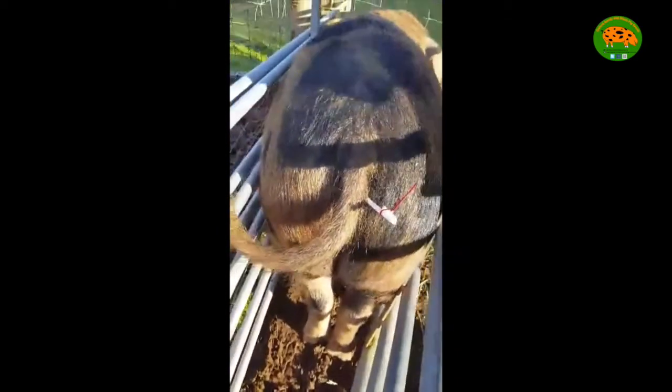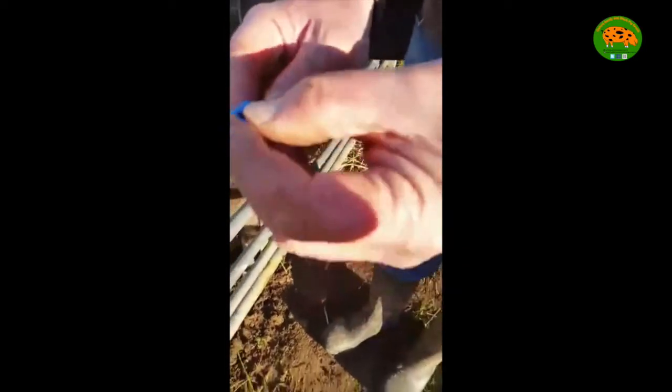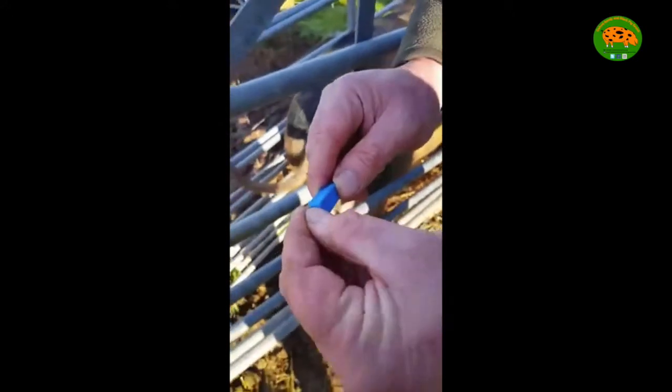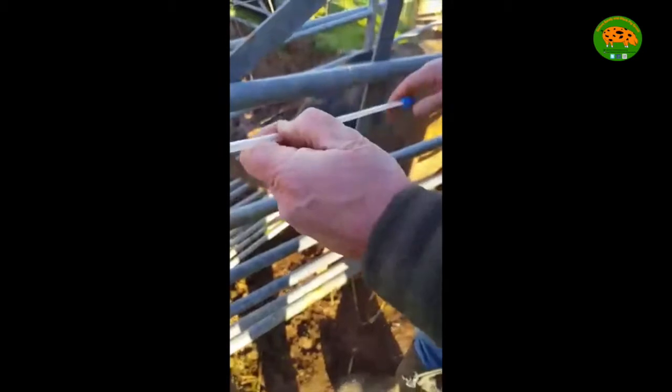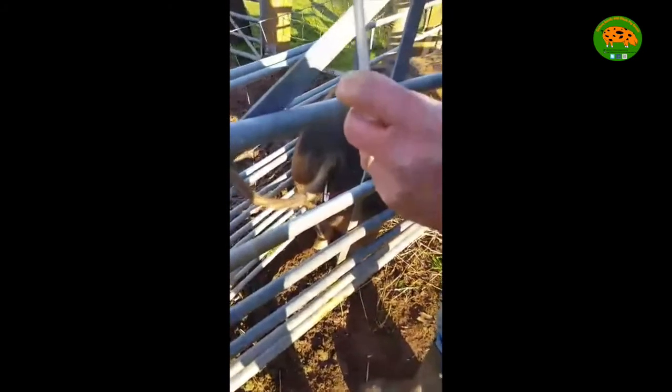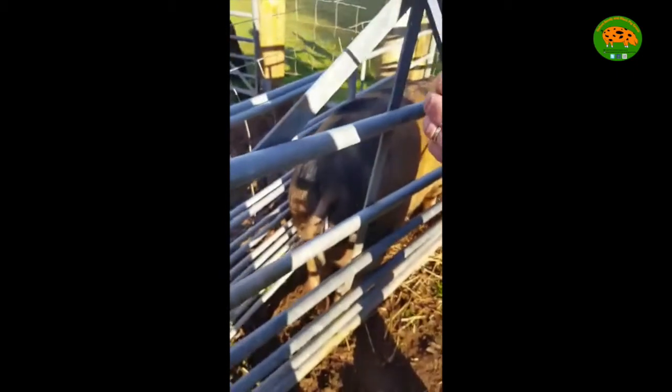With the Deer Park catheter, they have a cap on here at the end, so you wouldn't have to faff about with the electrical tie. And you could just leave that on the side for maybe 20 minutes and just give her time to absorb all that's in there.